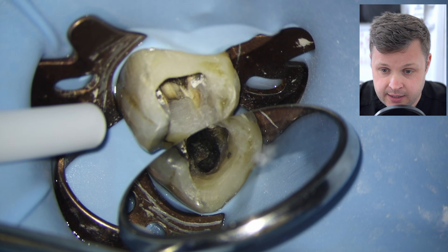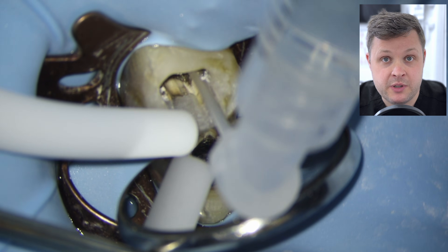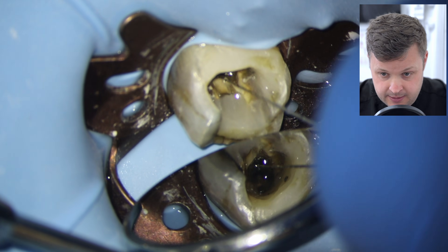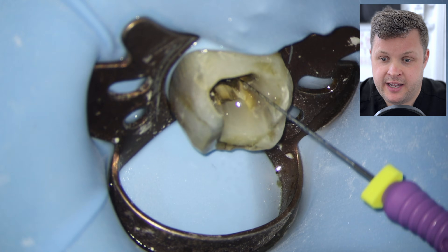I'm using the cone beam CT scan throughout to map out where I am, but we find a canal which isn't obvious on the CBCT — in fact it was more obvious than the one we could see on the scan. The first canal I'm looking for is the distal canal. This is low-hanging fruit — really easy to find once I've opened the cavity. I irrigate the cavity and place a size 10 K-file to get a reading on the apex locator.